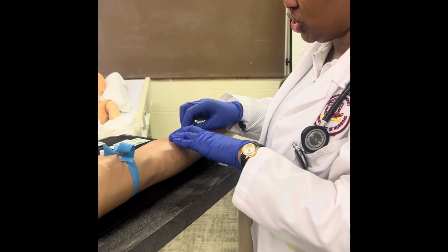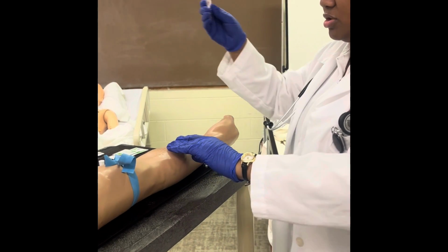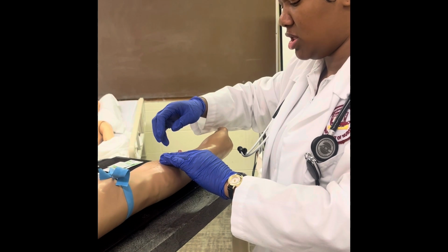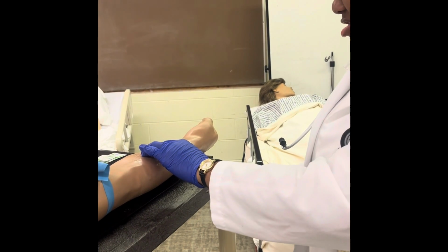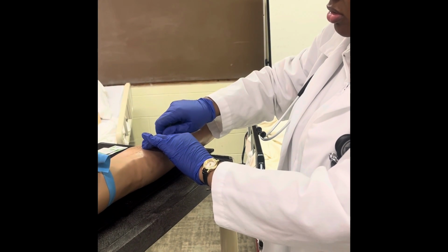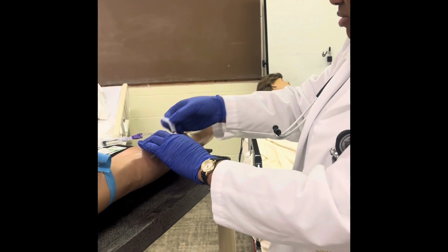Now I'm going to hold pressure and thread my catheter so blood won't go everywhere, and throw this into a sharps container. It's clamped. It's leaking. Just carry up and connect it. Okay. Connect my tube in. And then I can place a piece of tape down to keep it from coming out.